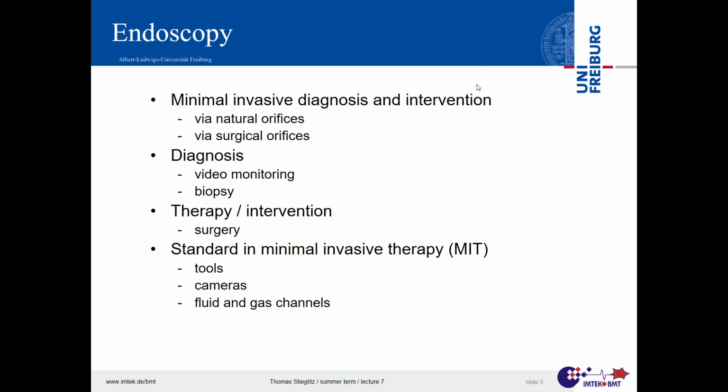So, first of all, a little bit about the idea of minimal invasive diagnostics and intervention, and then the diagnosis and the therapy as it is today, and standards that we have. So in the early days it was all about open field surgery. So you made large cuts, opened everything, looked in, surgeons could watch, and they could feel. That's quite important, at least in old school medicine, that you can palpate, that means feel what is in there. So if you have cancer in the liver, for example, you can touch the liver and you feel that.